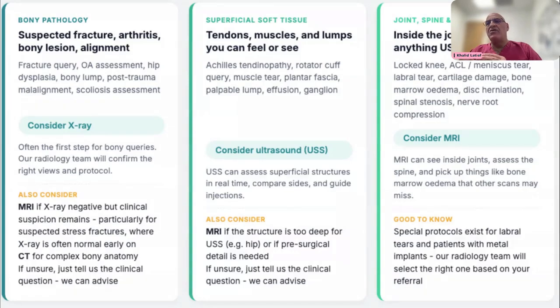You probably will not see that on a regular MR examination. So the surgeons ask us to confirm that the patient has a Bankart lesion, i.e. a labral tear. We then inject them with contrast aseptically under guidance.